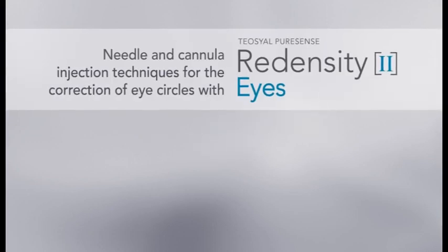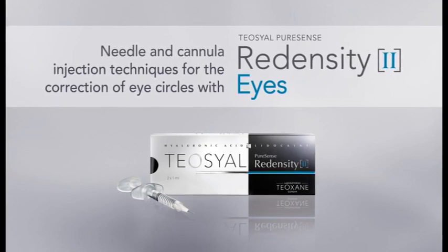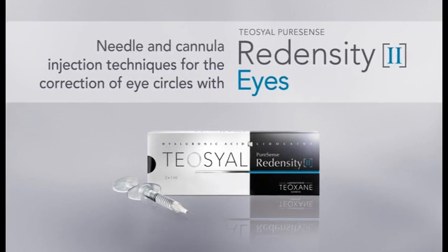This film presents the different injection techniques with needles or cannulas with a new filler, Redensity 2, developed specially for the correction of the suborbital region.